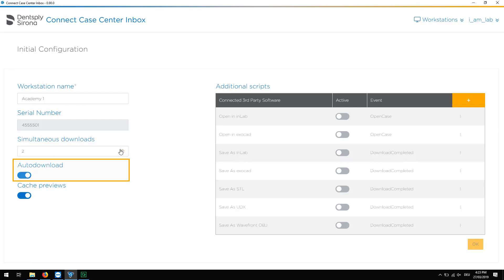Both the auto-download and the cache previews are enabled by default. If desired, you can disable these with one click. If the last option is enabled, the models will be cached locally. This speeds up the loading process when you want to display a 3D model again.